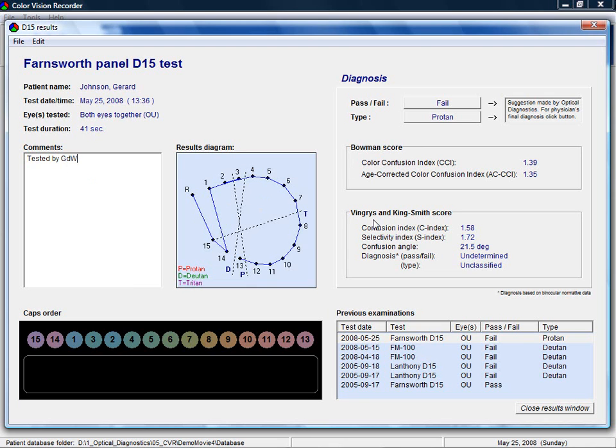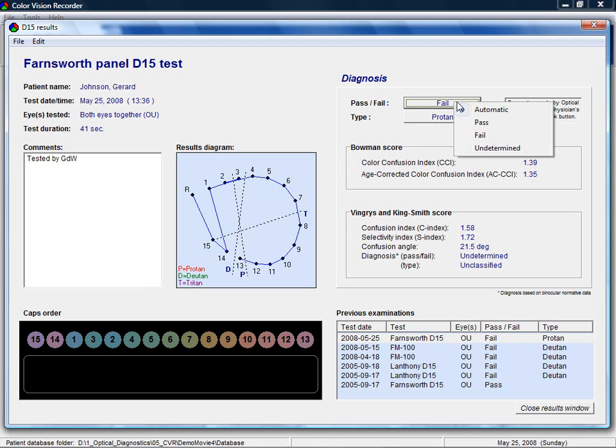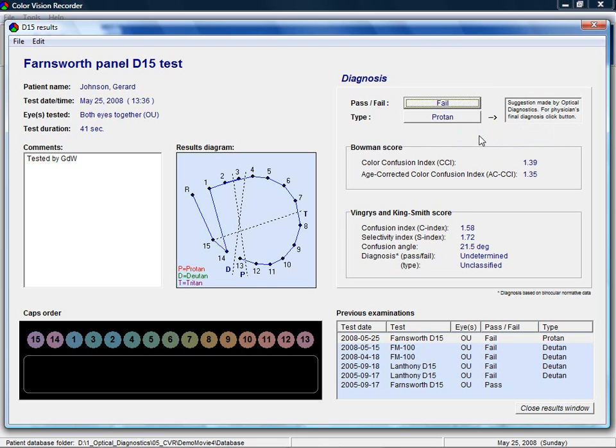At the top, the physician can make a final diagnosis of the test by clicking on the buttons. By default, the program gives a suggestion of the diagnosis based on the amount and direction of the large and small errors in the horseshoe diagram.